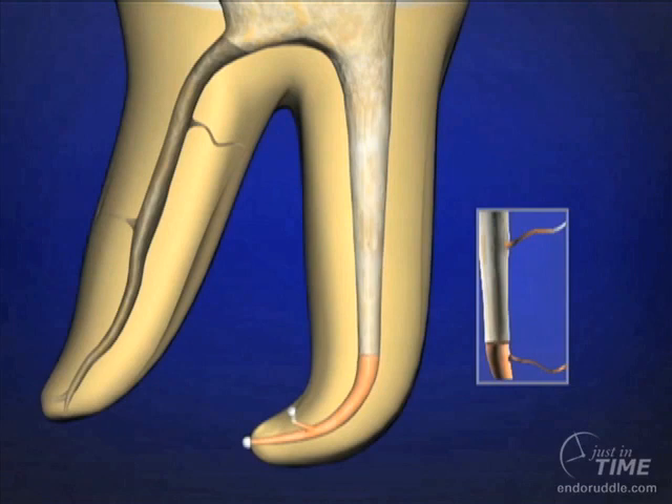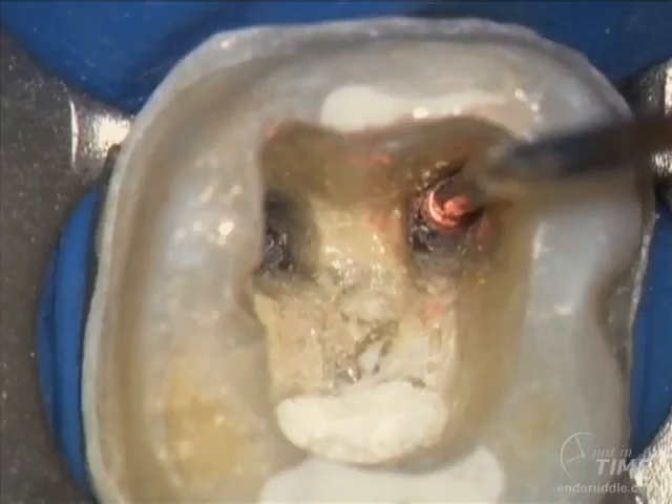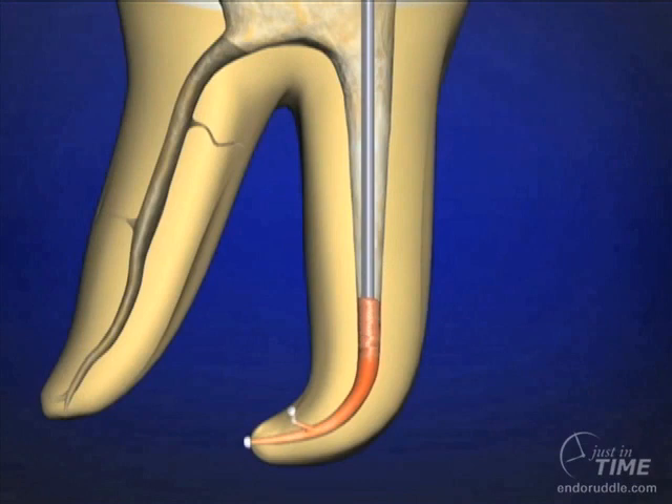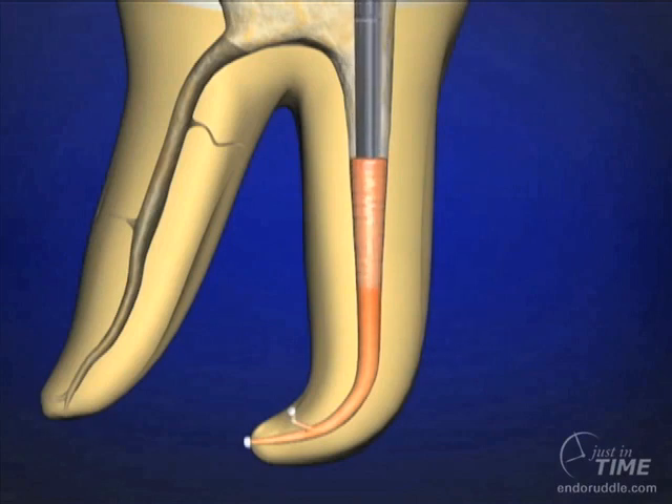The apical one-third has been corked. We're now backfilling using the Calamus Flow backfilling machine to inject thermally softened gutta percha into the canal. The first segment injected should be quite small — maybe 2 or 3 millimeters — so that we don't have a void. Step the plugger around the circumference of the canal, and a sustained press molds that rubber three-dimensionally. By setting the cannula on the previously packed gutta percha, it re-thermally softens the most coronal extent, creating cohesion between injected and previously established gutta percha.